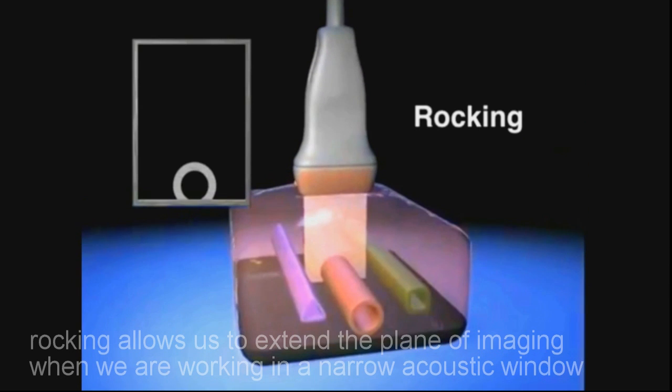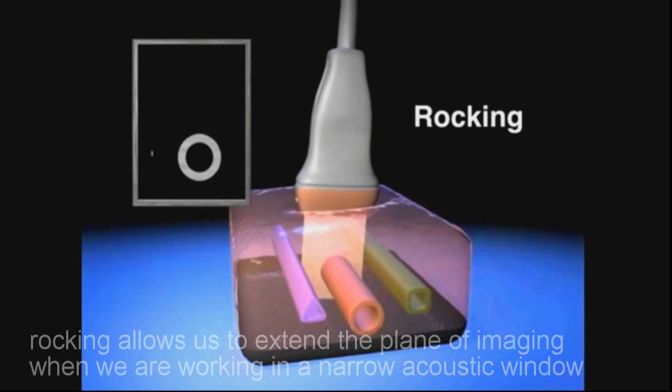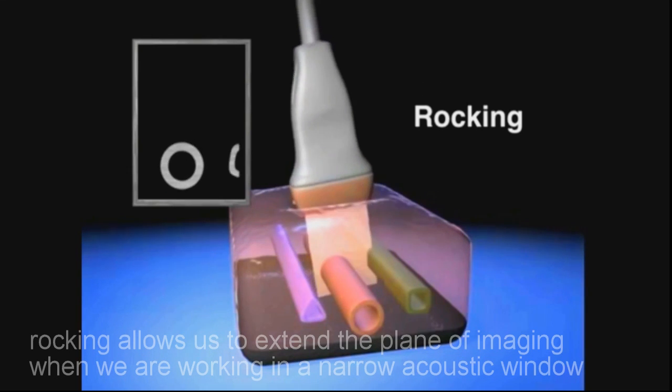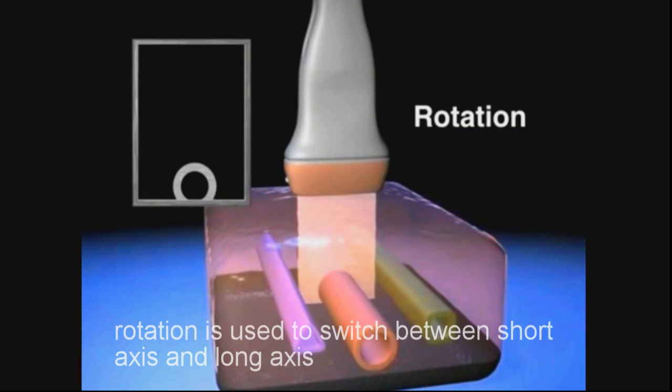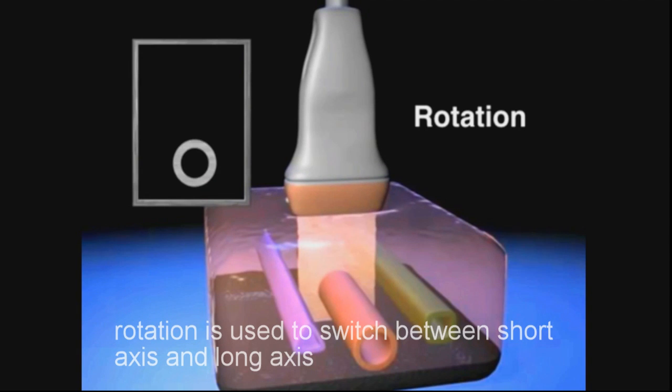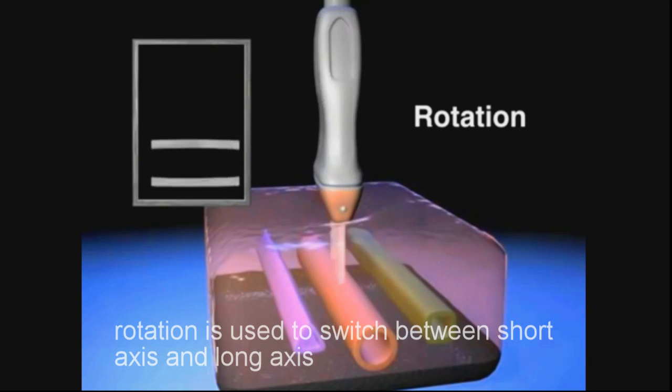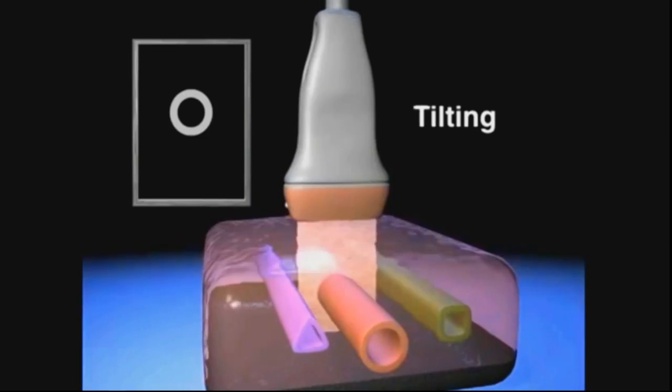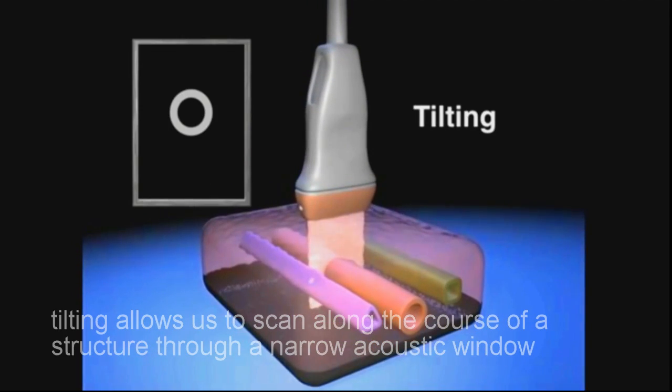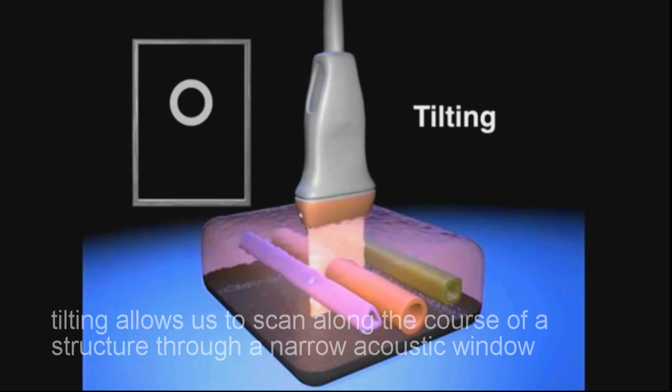Rocking allows us to extend the plane of imaging when we are working in a narrow acoustic window. Rotation is used to switch between short axis and long axis. Tilting allows us to scan along the course of a structure through a narrow acoustic window.